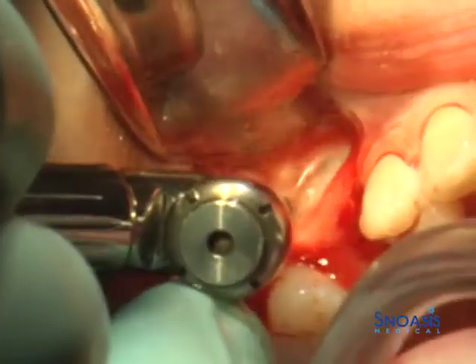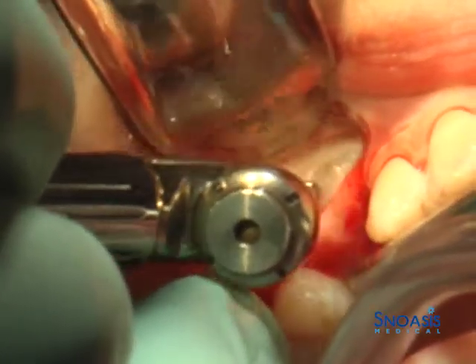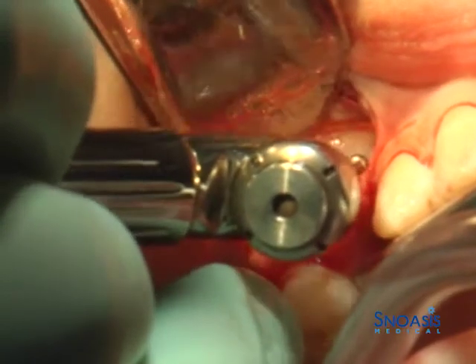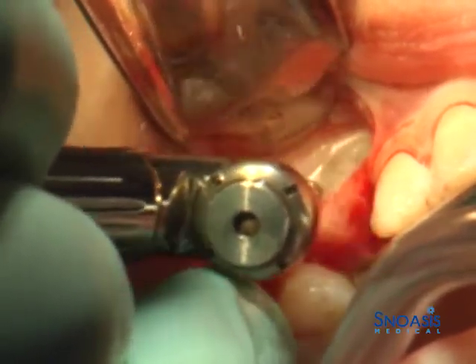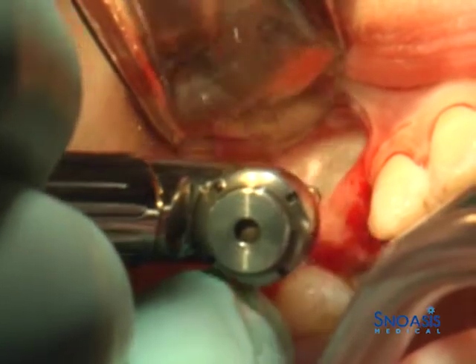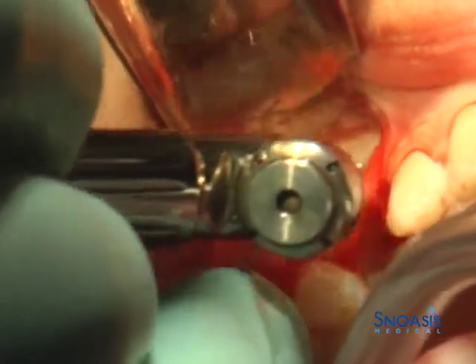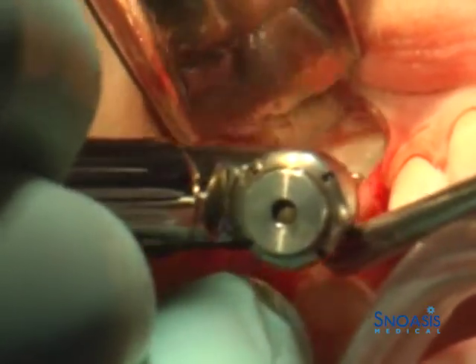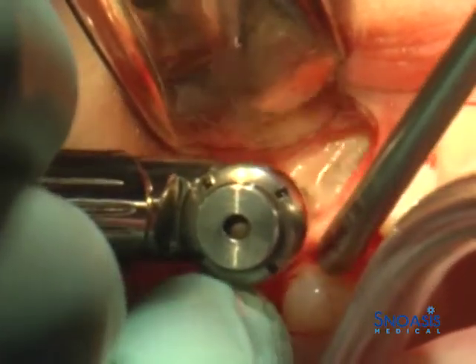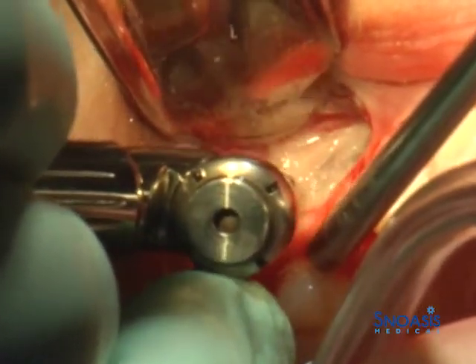A surgical high-speed handpiece is used to perform the initial osteoplasty in the area of the lateral maxillary wall in the edentulous area number four, down to the level of the tinted Schneiderian membrane, prior to the application of a piezoelectric surgical handpiece.